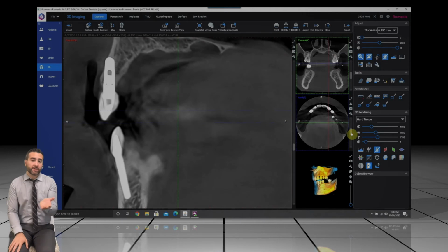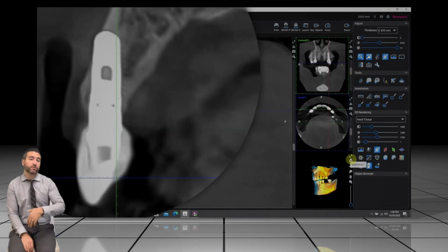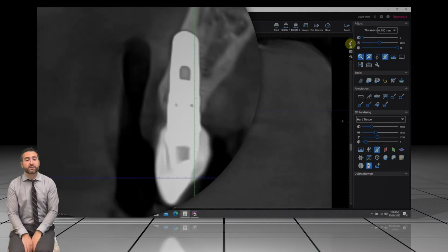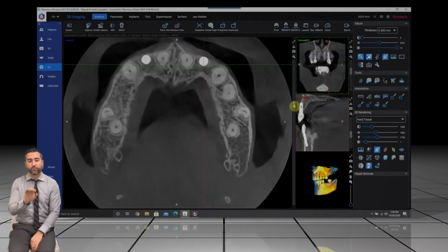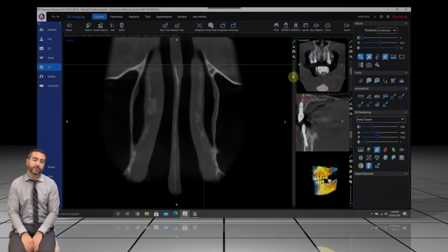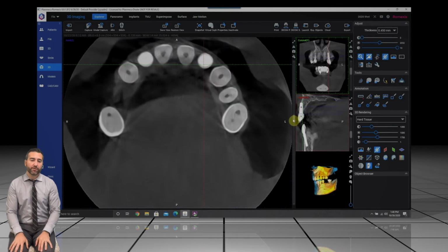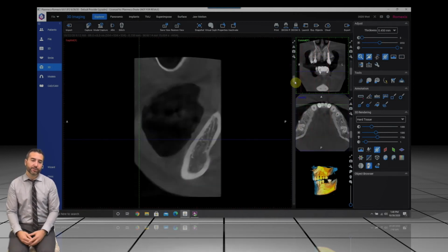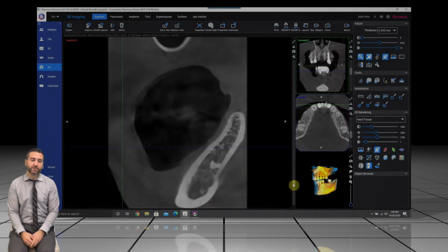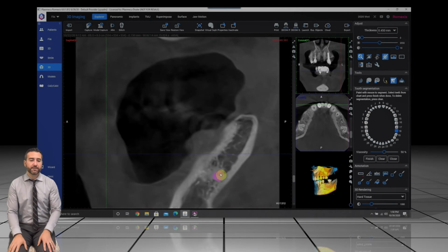The patient has been elsewhere for consults and they were told they might need grafting, they might not, they won't know until they get in there, all sorts of things. You're going to be able to definitively tell this patient not only what kind of grafting they need, if any, but exactly what implant sizes we could fit in there. And then I also go through the whole thing of these are going to be completely guided. I call it pinholes. We're going to just do tiny little holes in your tissue. We're not going to have to do major grafting.